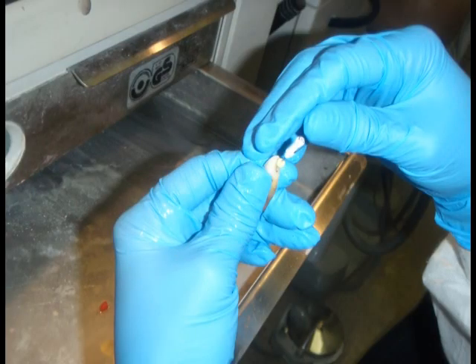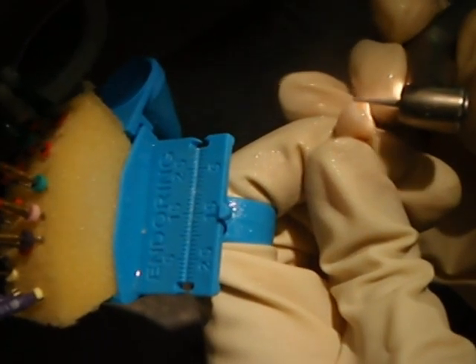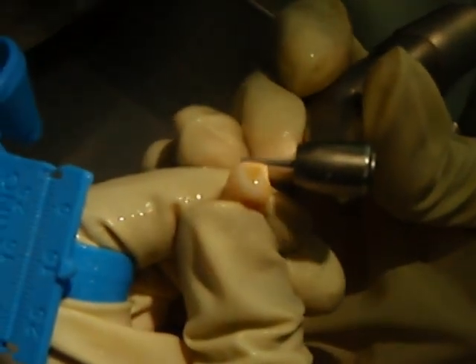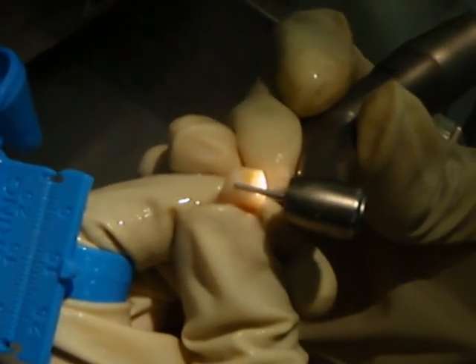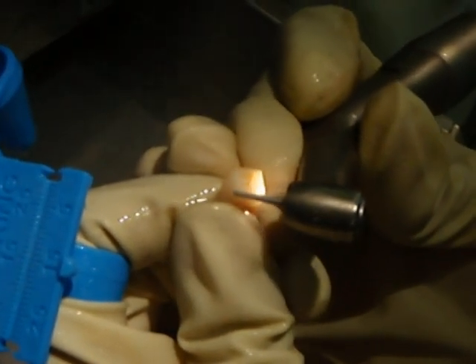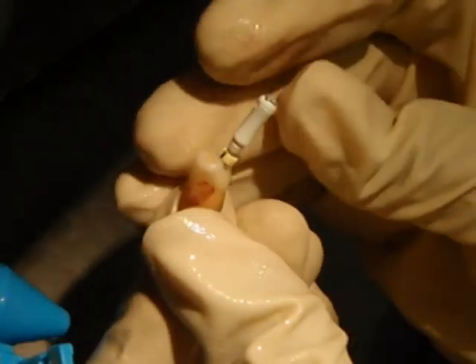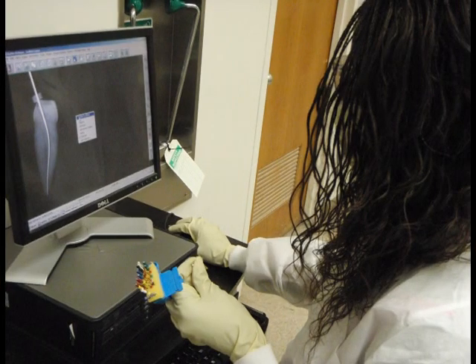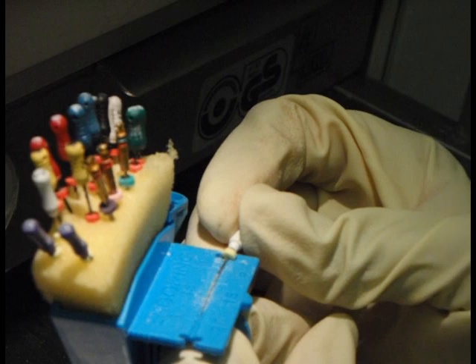Next, working length will be determined. The files used in this project are too short to reach the minor apical constriction. Therefore, we will carefully reduce the cusp until the size 15 scouting file can reach the apex. Working length radiographs are then obtained and file working length is measured.